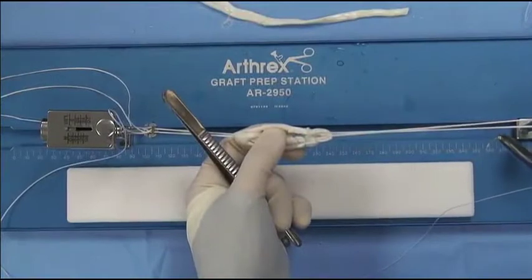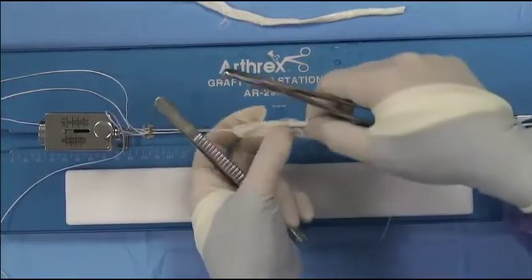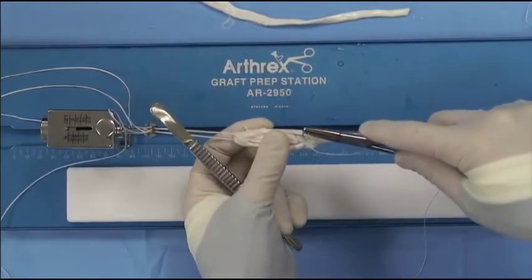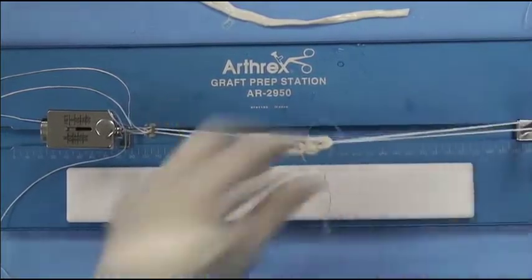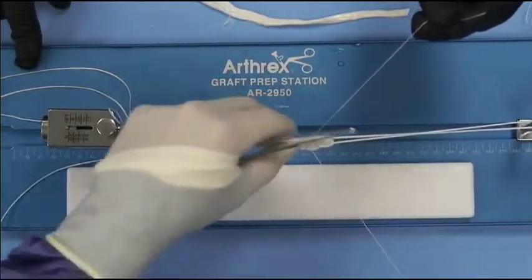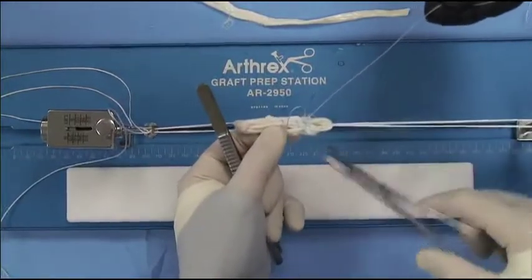I'm going to take my number 0 FiberWire and do it one more time with the buried knot technique. So I'll make sure I come in through all 4 strands, but with the buried knot. So there's number 2, number 3, and number 4. And then you'll have 2 on this side, which is the tibia side, which is really going to secure the free ends. We'll get these nice and even.